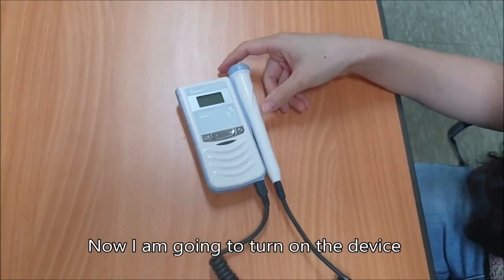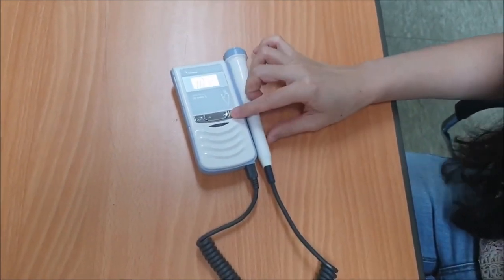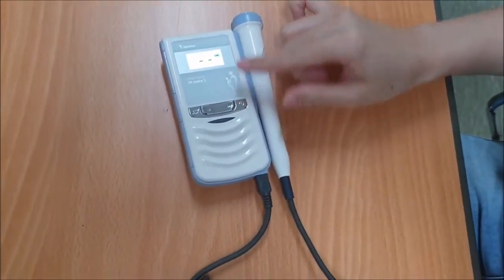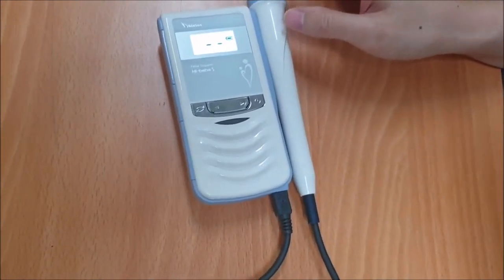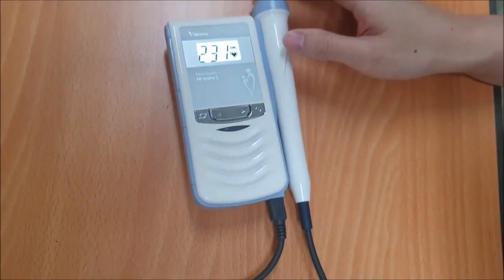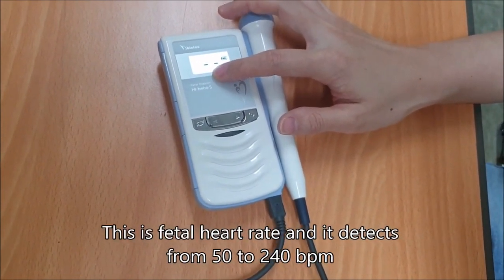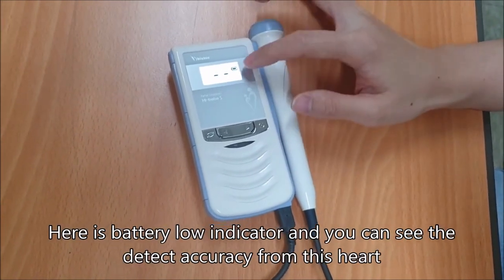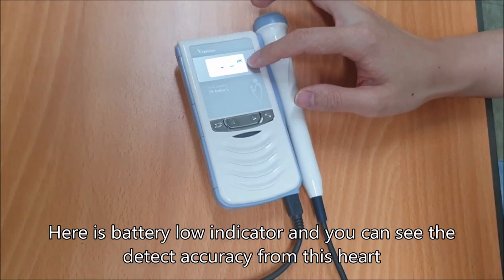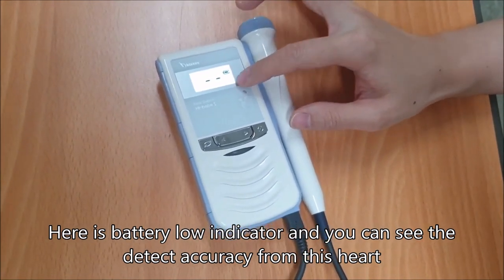Now I'm going to turn on the device. This is the fetal heart rate display and it detects from 50 to 240 BPM. Here is the battery low indicator and you can see the detect accuracy from this heart icon.